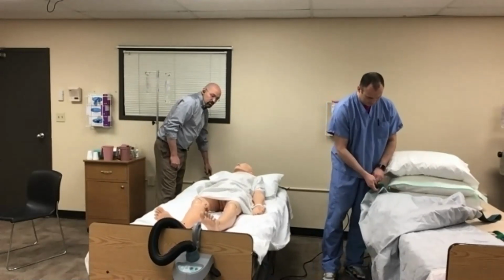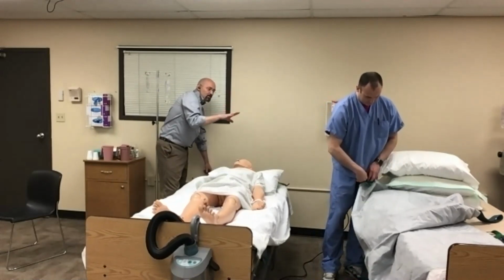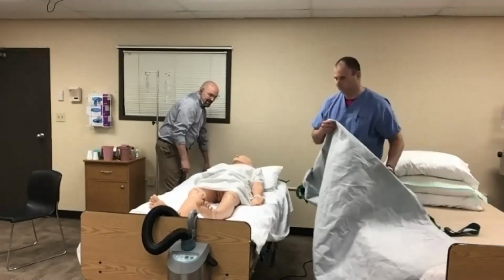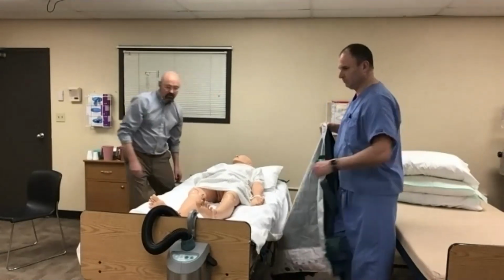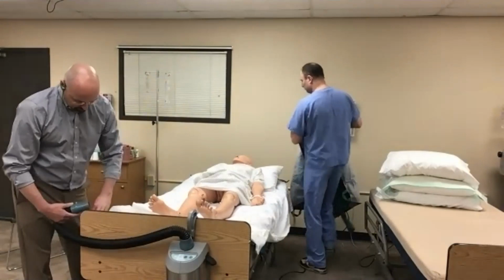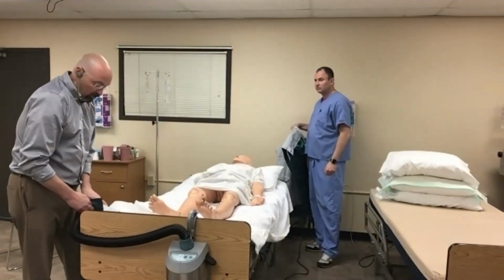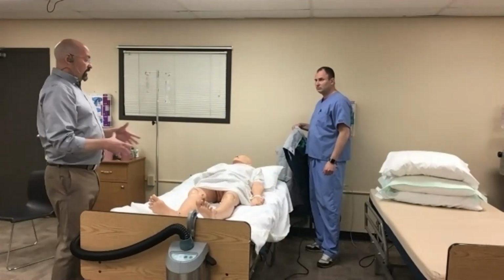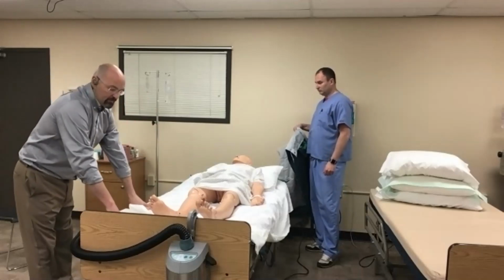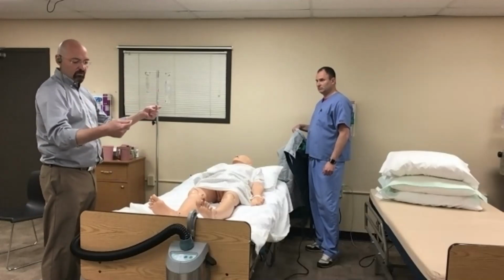So the first thing we're going to do in this scenario is get everything ready. We've got a second HoverMatt, our pillows and our draw sheet. We're then going to bring the bed up to the highest position possible and make sure we disconnect the link system from the HoverMatt or from the mattress. We're going to hook our air transfer device up and apply a HoverMatt right under the same place, because as we prone him, we're going to be removing the top HoverMatt he's on and putting a new HoverMatt underneath so we can then supine him back when we're all set.